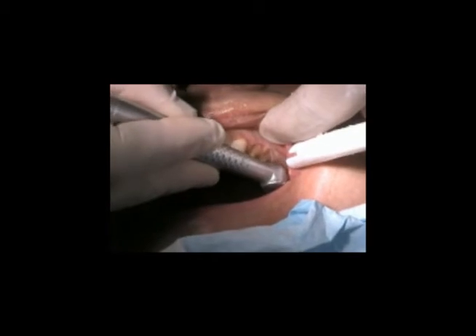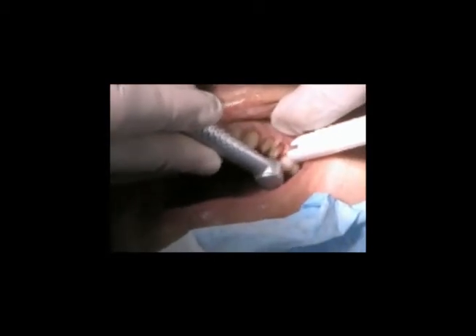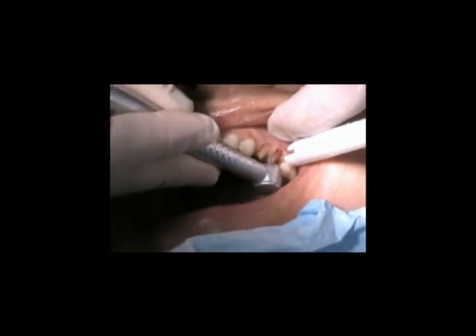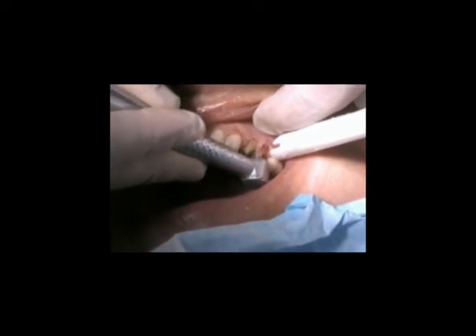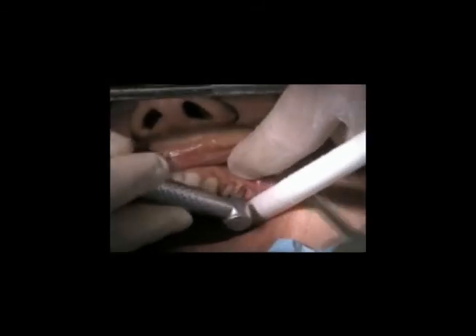Now we're going to see the dual use of lasers in practice on a full arch case. Here we're doing some troughing around the preps so that we don't use cord and we get a good impression.